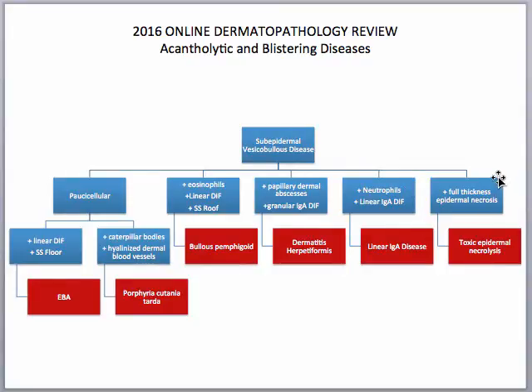If you have a subepidermal cleft accompanied by full thickness epidermal necrosis, then you want to think of toxic epidermal necrolysis. Now let's use some of these simple clues to look at some of the online cases and see if we can arrive at the diagnoses.